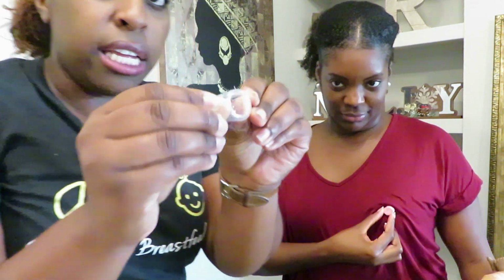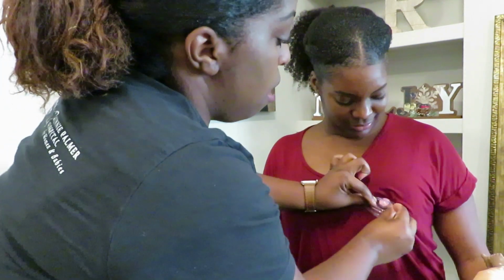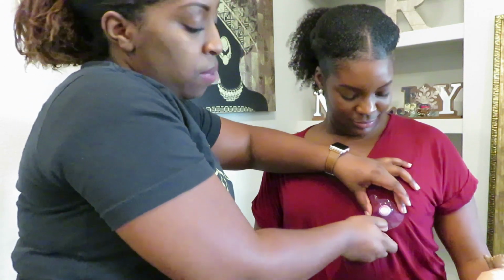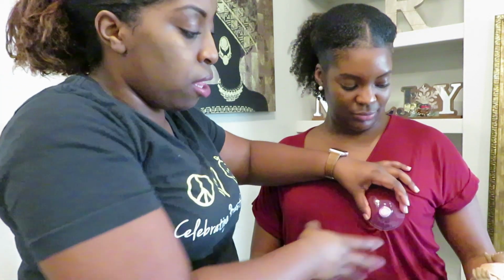You're going to fold the nipple shield in so you can get it as close as possible, and then slowly let it come out so your nipple is actually in the shield. You'll know that the baby has a good latch because you'll start to see some colostrum gathering in the nipple shield, and the baby can get on that way.